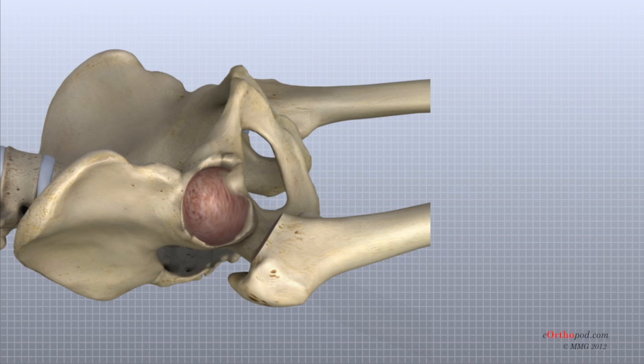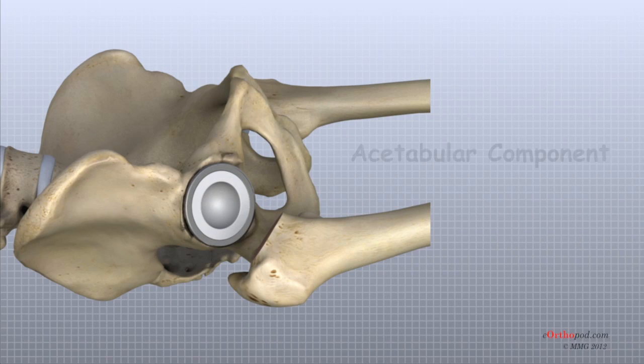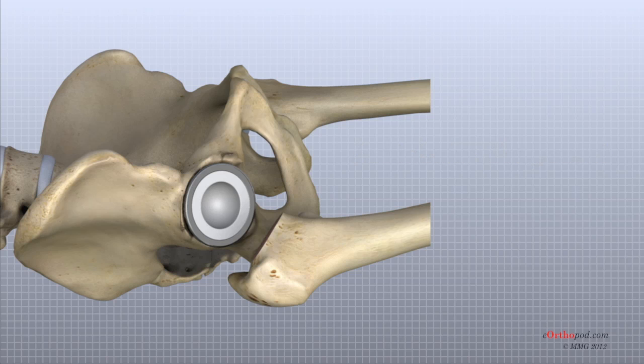The surgeon shapes the socket into the form of a half sphere. This is done to make sure the metal shell of the acetabular component will fit perfectly inside. After shaping the acetabulum, the surgeon tests the new component to make sure it fits just right. In the typical artificial hip replacement, the metal shell is held in place by the tightness of the fit, or in some cases, by using screws to hold the shell in place.